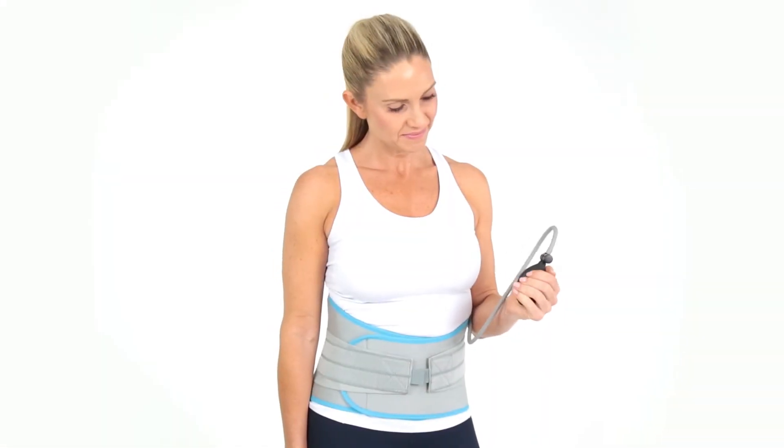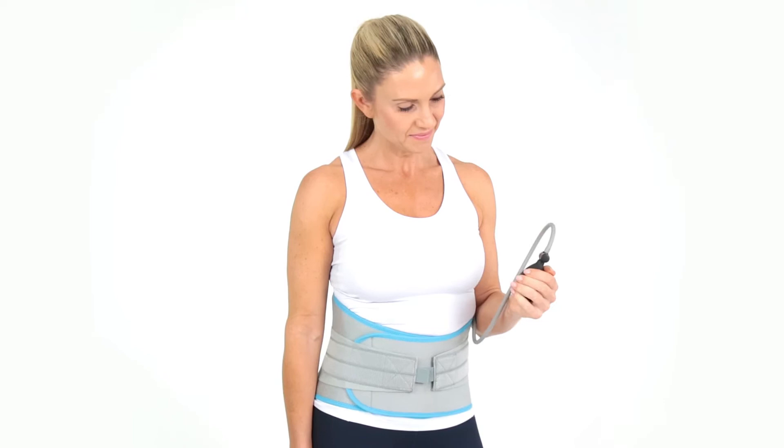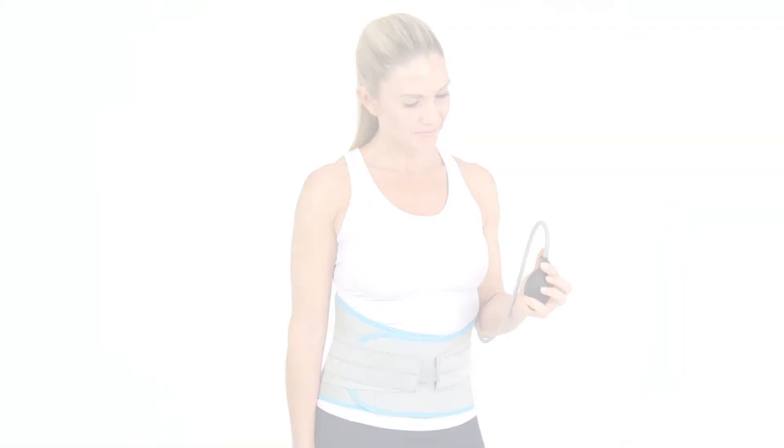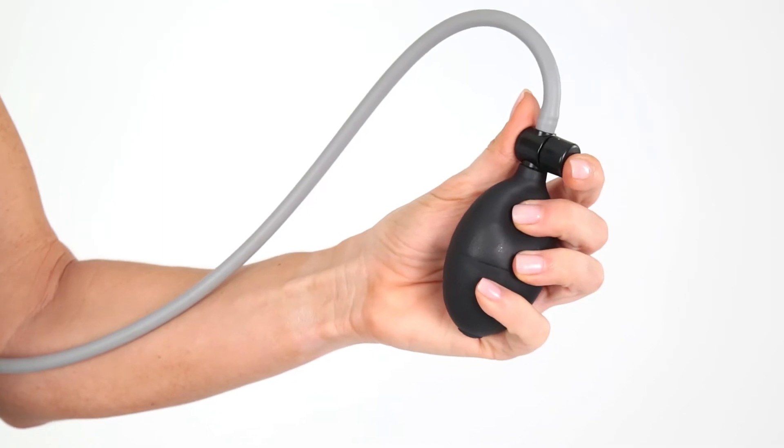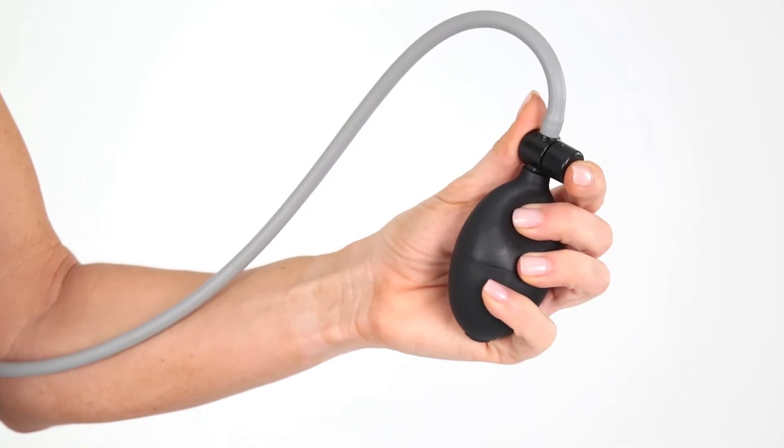Grab the balloon pump and inflate the brace to your desired compression. If you've applied too much compression, you can release air by pressing the deflation pump on the side of the hand pump.